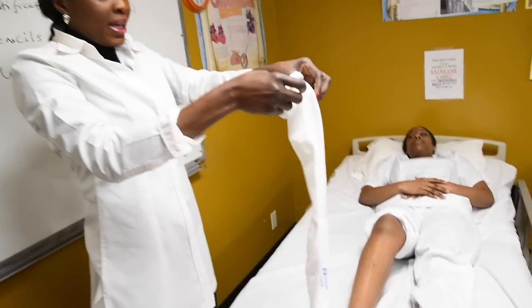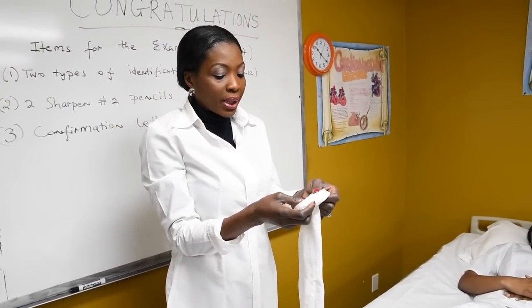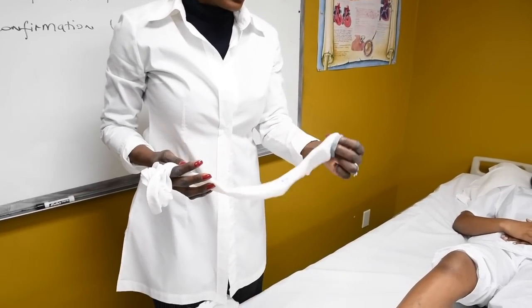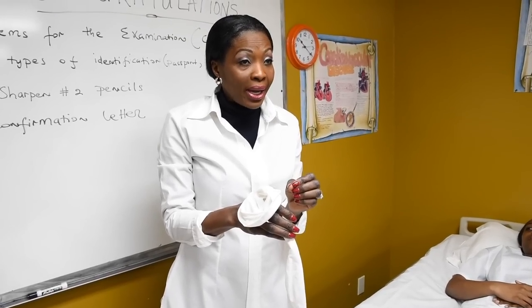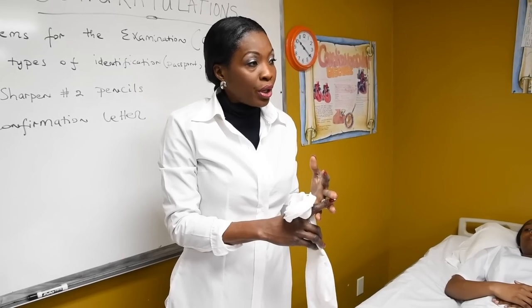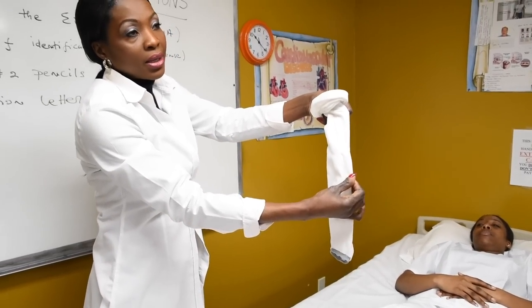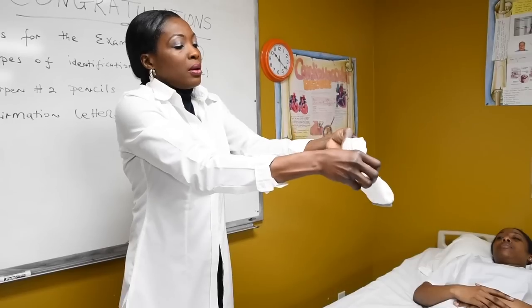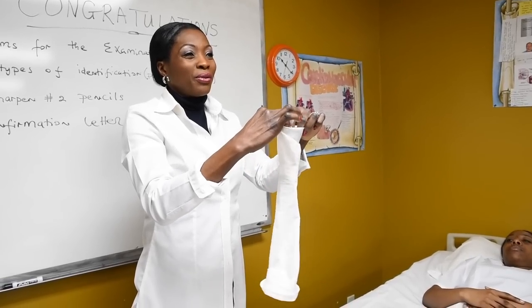To apply knee-high elastic stockings, there is a specific instructions in doing this correctly. When you take elastic stockings, it has this hole at the end of it. The skill says fold the elastic stockings at least to the heel before you put the stockings on the foot and then on the leg, all right? So this is what you would do. You're gonna gather the stockings. This is the heel of the stockings. All the way to the heel and fold it onto itself.